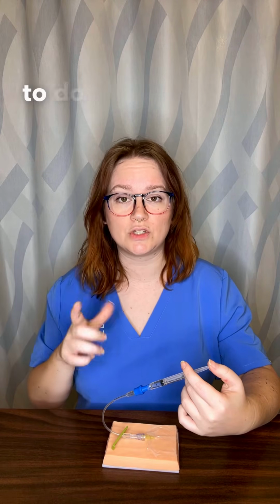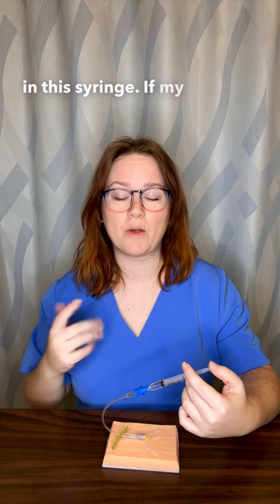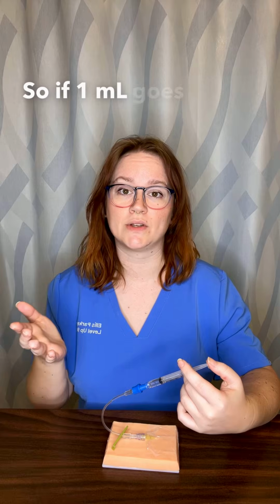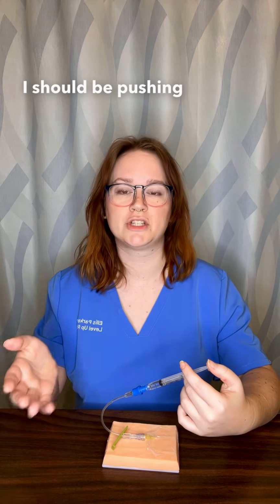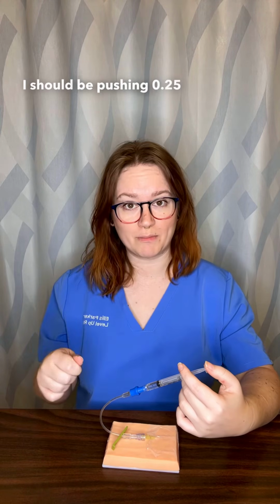So what I like to do is break it up into pieces. I have 1 milliliter of medication in this syringe. If my order is to administer that over 1 minute, then I like to break it into smaller increments. So if 1 milliliter goes in over 1 minute, then over 30 seconds, I should be pushing 0.5 milliliters, right? And over 15 seconds, I should be pushing 0.25 milliliters.